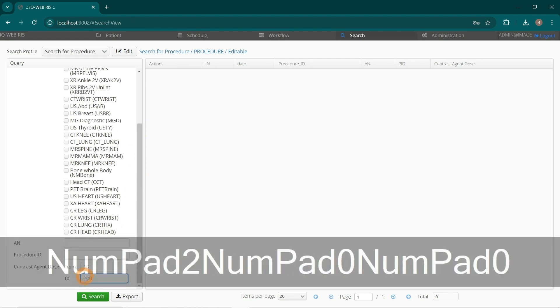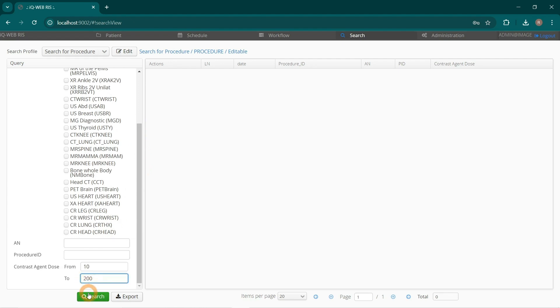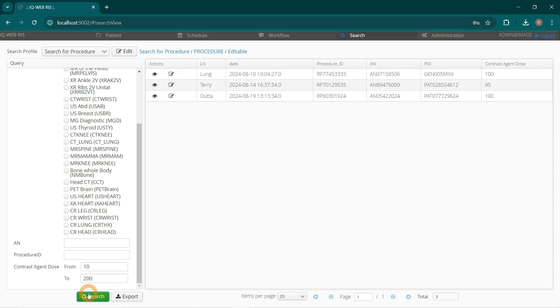Click the green Search button. All Procedures for this Time Frame and Contrast Agent Dose Range are listed in the Result Table. Thank you for your attention.